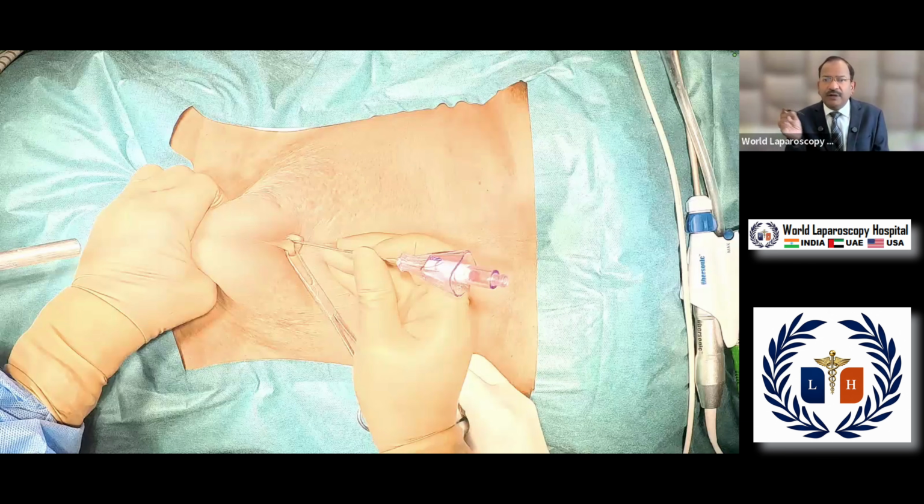And without lifting, if you will go towards the anus, there is a chance your Veress needle will slide over the preperitoneum. But after lifting, if you will go towards the anus, you can never injure aorta, vena cava or common iliac vessel. It is impossible. Why? Because it is not there. Aorta is bifurcating into two common iliac vessels 5 centimeter above the sacral promontory. And I am pointing towards the anus. So how can I enter into aorta or vena cava? Never. And if I am lifting the abdominal wall, then it is not possible that my Veress needle will go preperitoneum.